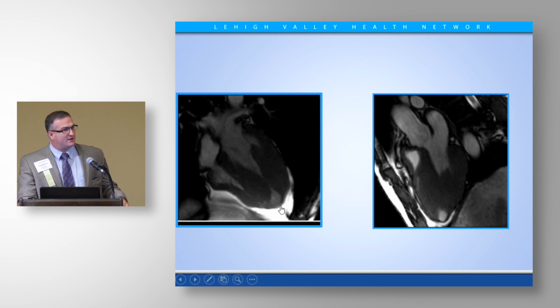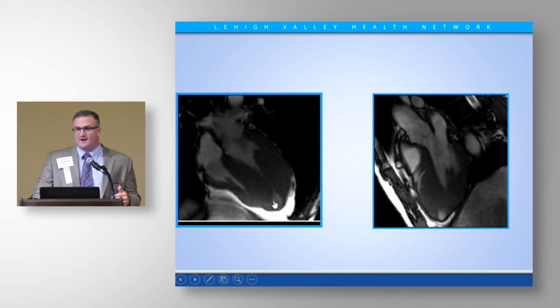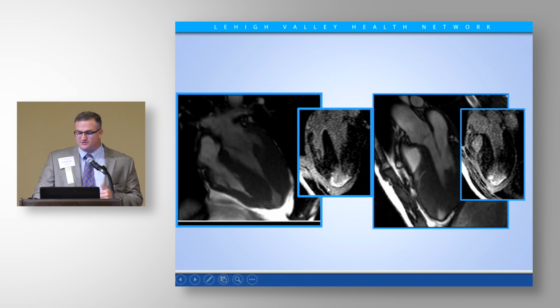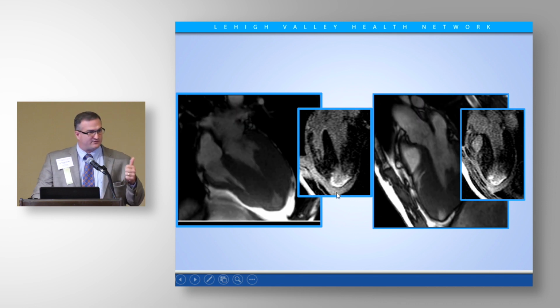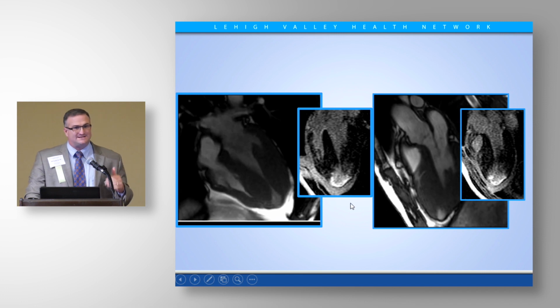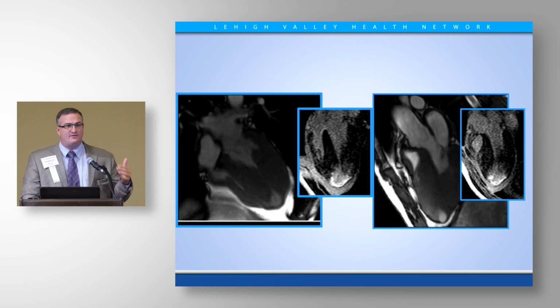We know that if there's some pouch formation at the tips of the ventricle with hypertrophic cardiomyopathy, the outcomes can be worse, and it's often associated with scar. Higher risk for VT, higher risk for heart failure, higher risk for thromboembolism. So identifying this and acting on it is critical beyond the diagnosis.